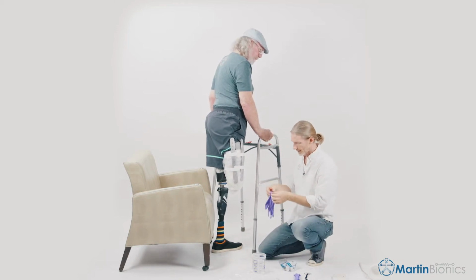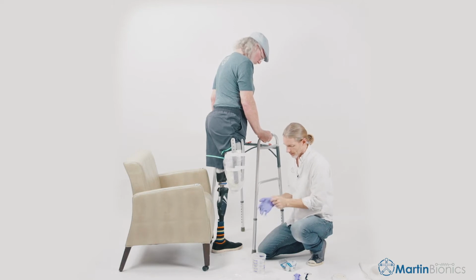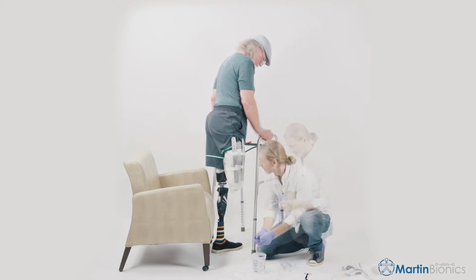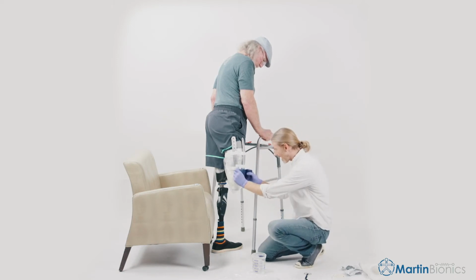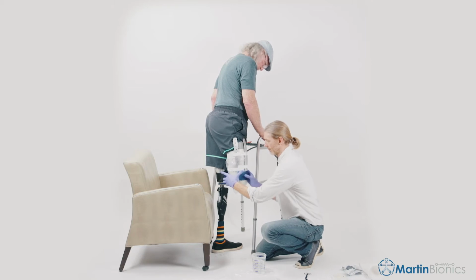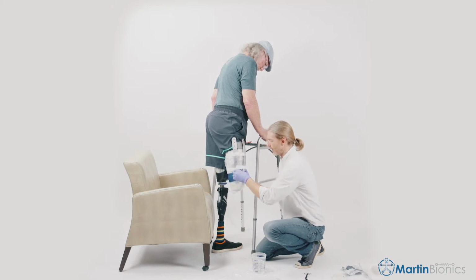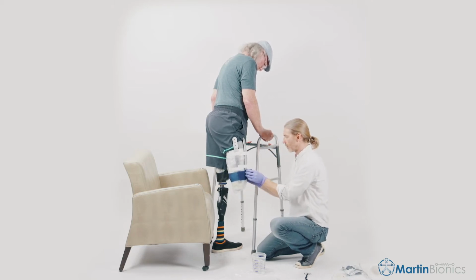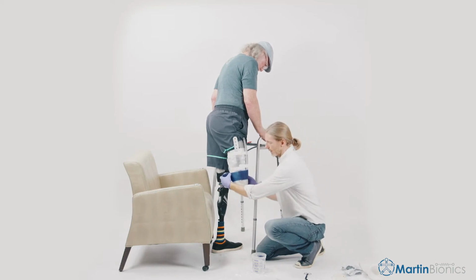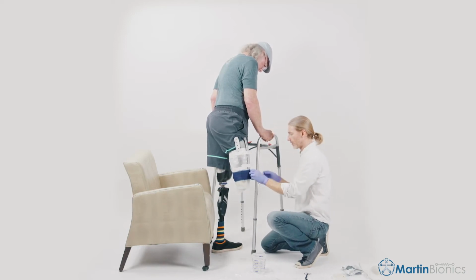Let's go ahead and take a cast. Capture the shape and contouring of where those sit. Again, I'm just going to cast about 1 inch below our flexible inner socket so that we have the nice transition point more proximally. And if we cast this real well, we won't even have to do any trim work.